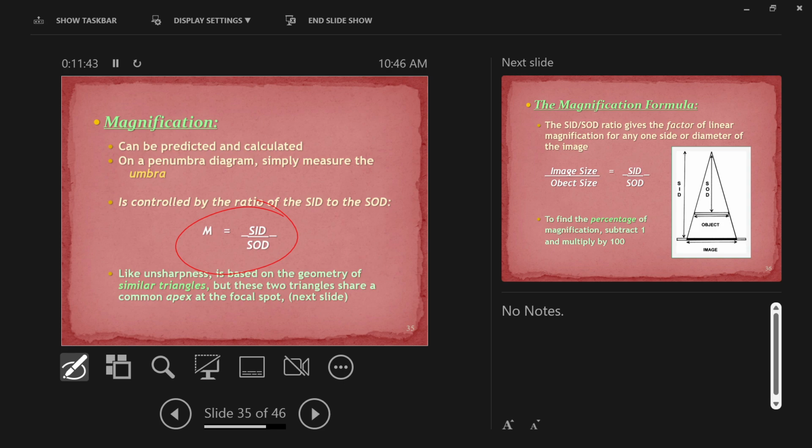Like I did in this one, okay? This is pretty realistic. An object is 3 millimeters larger on the X-ray than it is in the real world. It's not going to make a difference to you on screen that the object is 3 millimeters larger, right? The image is sharp. That's what you're caring about, okay? And then there's that relationship: magnification and sharpness go together, right? Things get magnified when you have a large OID and a small SID. Things also get unsharp in those circumstances too. So we want to minimize magnification, maximize spatial resolution detail, and those 2 things go sort of hand in hand with each other.